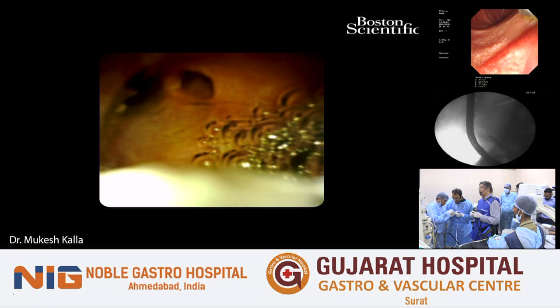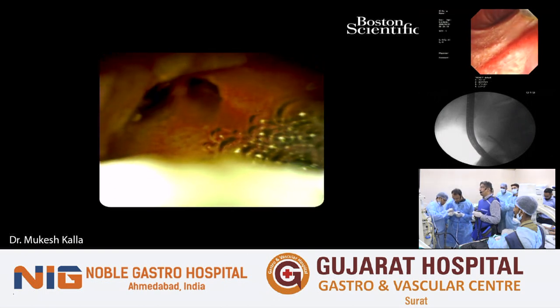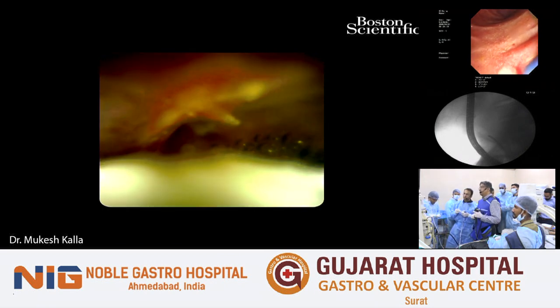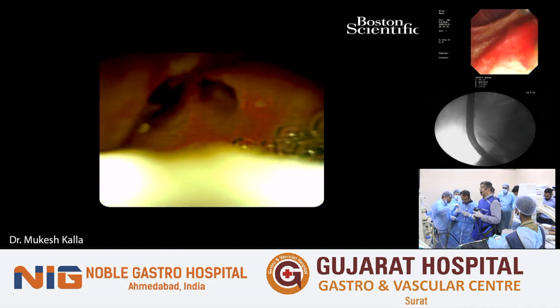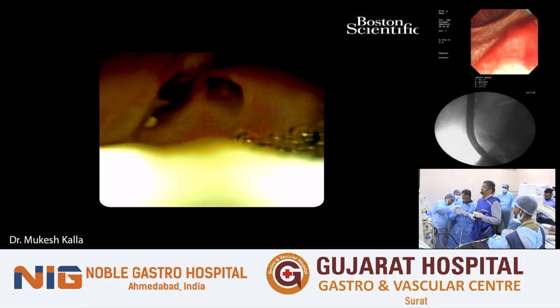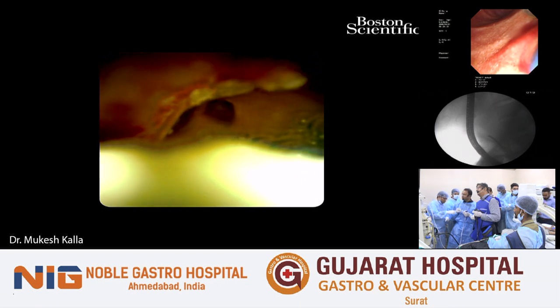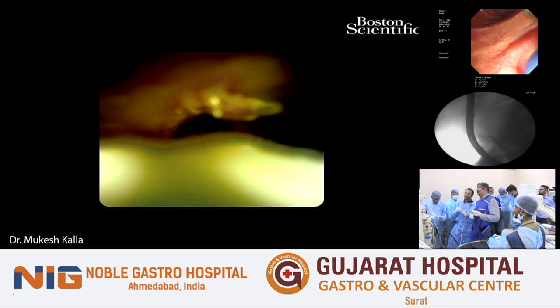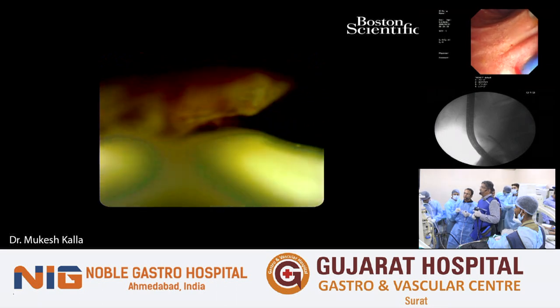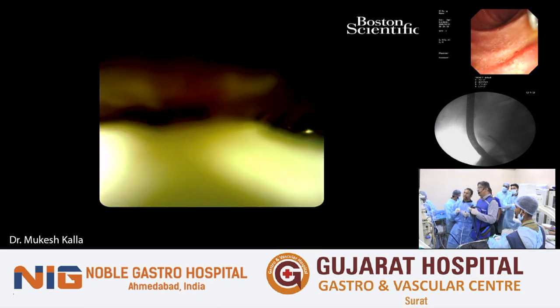One, it saves my scope. It saves injury to the common bile duct through my scope, and it facilitates easy passage of fragments, which we have done already. So I would probably recommend at least 12 to 15 mm of sphincteroplasty if you're dealing with a stone which is 2 centimeters and above. I think the only challenge lies in the water not staying, because it all flows out and then can be a problem. Yes, that's quite a valid point. Though I have not encountered it, the literature says that the flushing doesn't hold the water inside the common bile duct when you have a wide sphincterotomy.